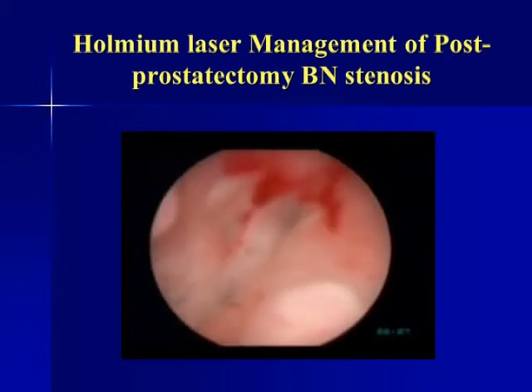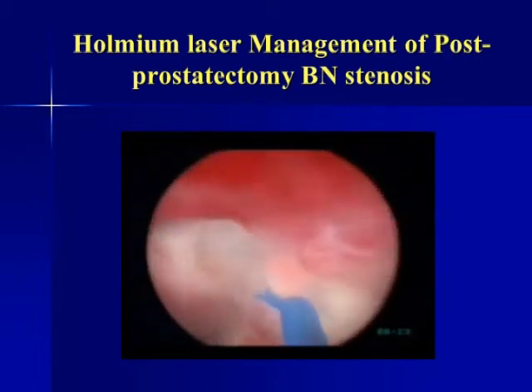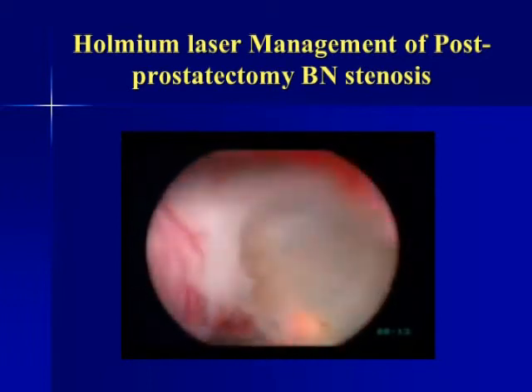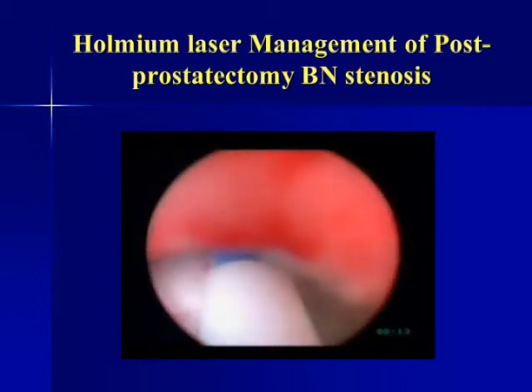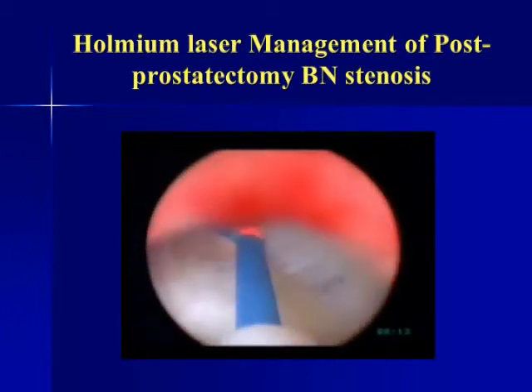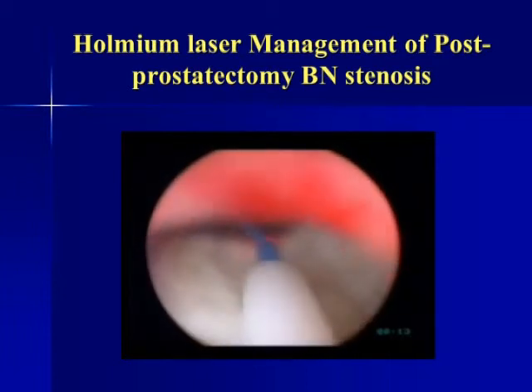It is again a good laser for post-TUR or open prostatectomy bladder neck stenosis. Here we not only incise the fibrous tissue, we can vaporize it and resect it also, so as to make a very wide cavity at the end of the procedure. This patient had an open prostatectomy and a very narrow bladder neck. So we are basically cutting the fibrous tissue.